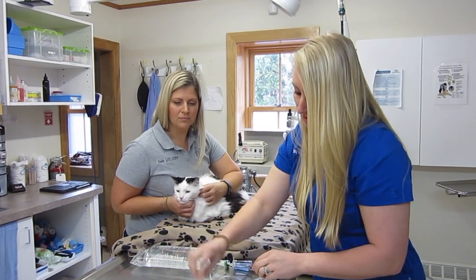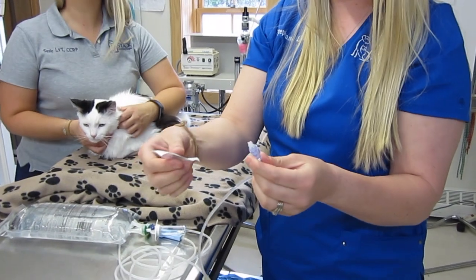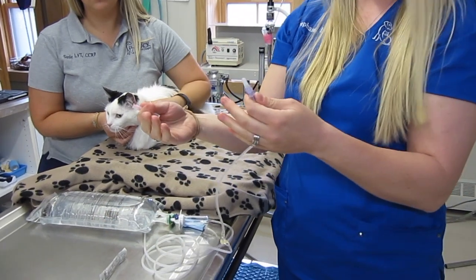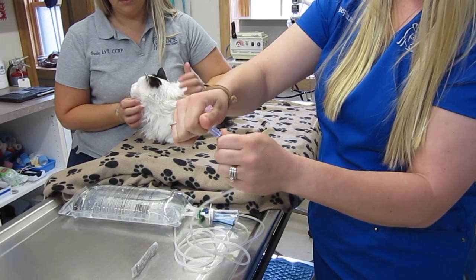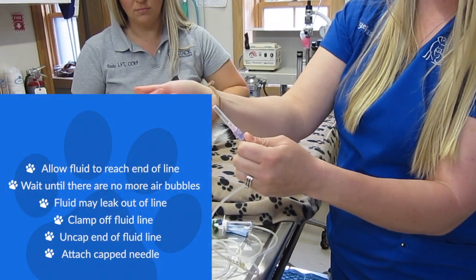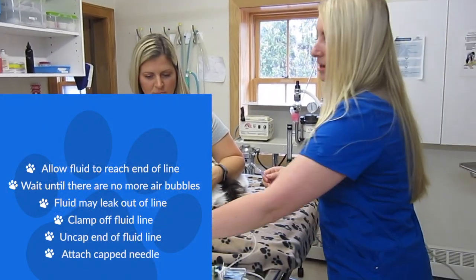The next thing you're going to want to do is uncap the end of your line and actually attach the needle. And we usually use anywhere between 16 and 18 gauge needles. It just depends on the patient. So you will undo the end of the line and then screw the needle on just like that. And then your set is ready to go to administer the fluids.